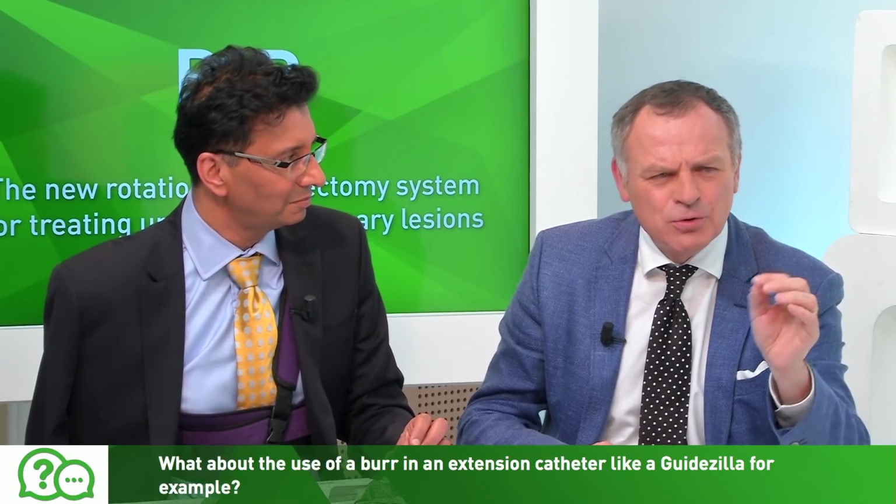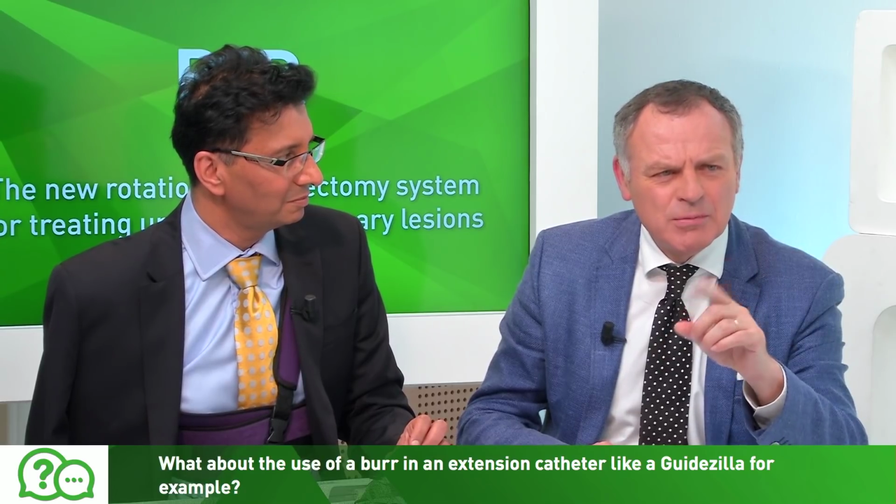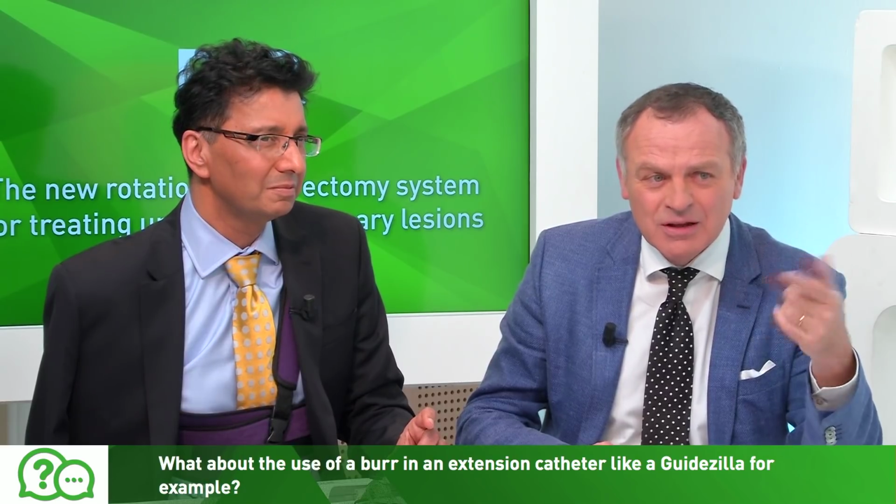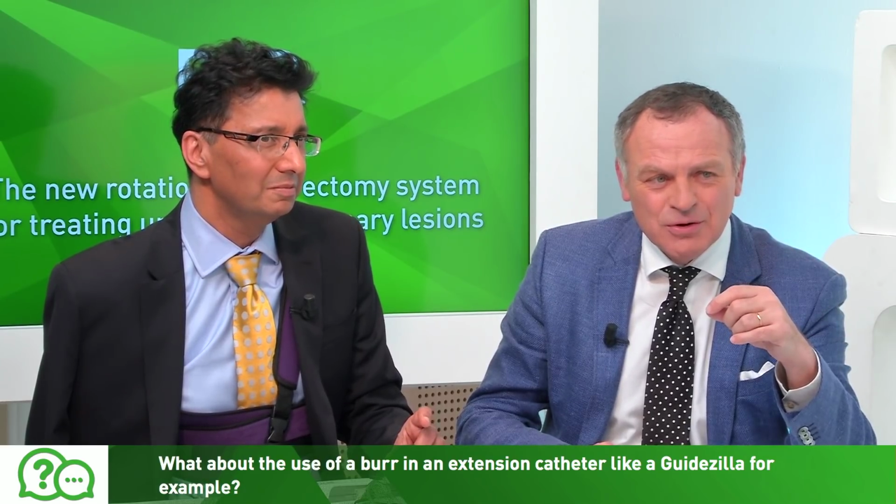It's certainly something I've done occasionally for very distal lesions, where essentially one of the restrictions is, of course, you can only advance within the length of the advancer, but you do have to use a large guide to get sufficient size in. But certainly you can use supported Guidezilla catheters for that. I will add maybe just a technical point. If you use the Guidezilla or the GuideLiner, you may be able to advance the burr, but do not retrieve the burr with the Dynaglide, because I think that it's not compatible with the Guidezilla or the GuideLiner.